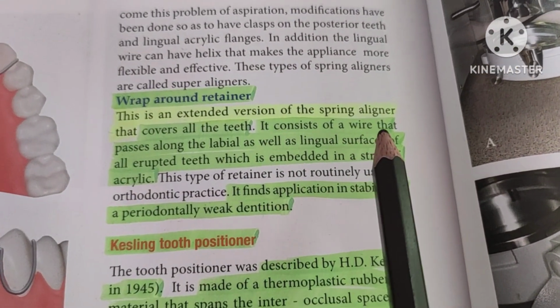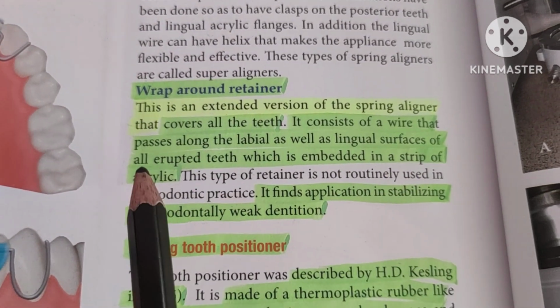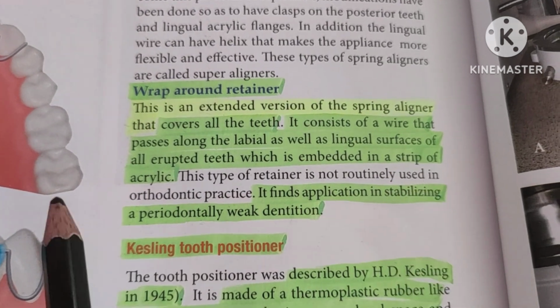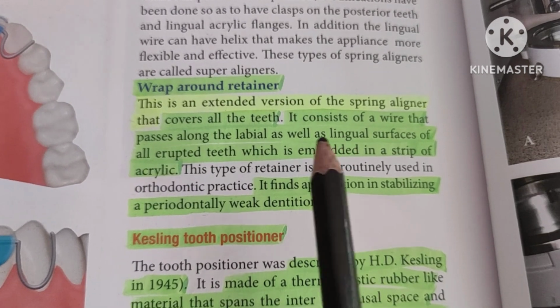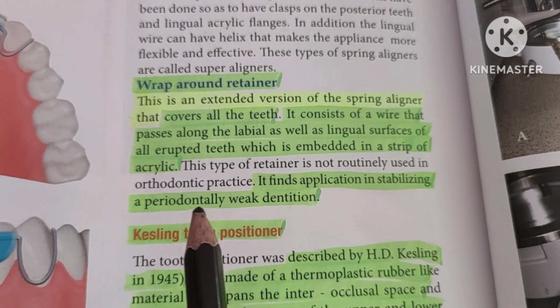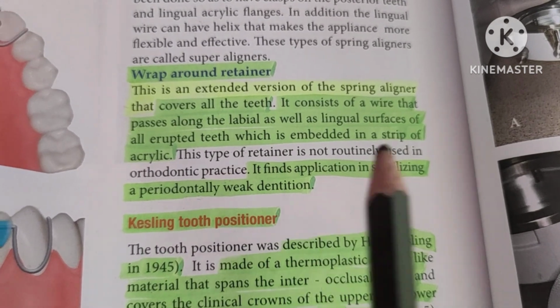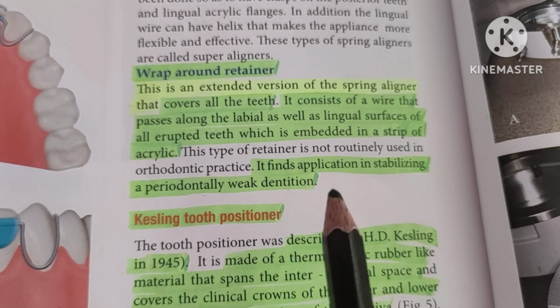It consists of a wire that passes along the labial as well as the lingual surfaces of all the erupted teeth, which is embedded in a strip of acrylic. First, there is a wire framework on the labial as well as lingual surface. Now that wire framework is embedded into a strip of acrylic. It finds application in stabilizing periodontally weak dentition, that is, in conditions where periodontally weak dentition is present.